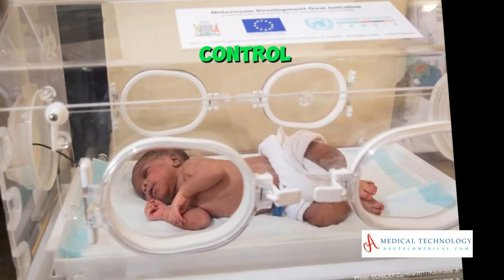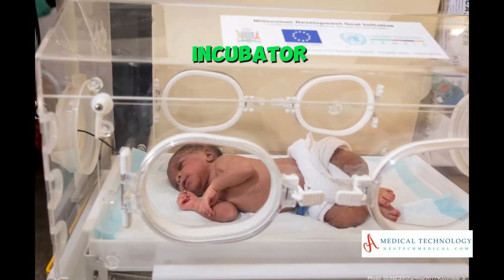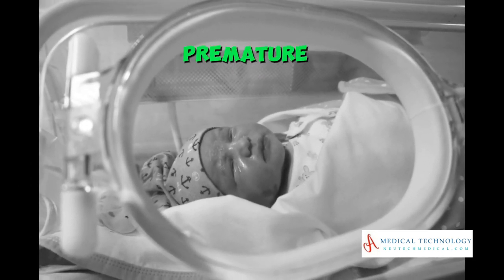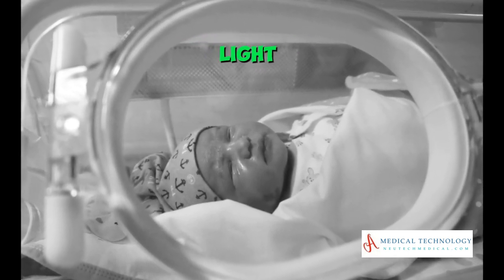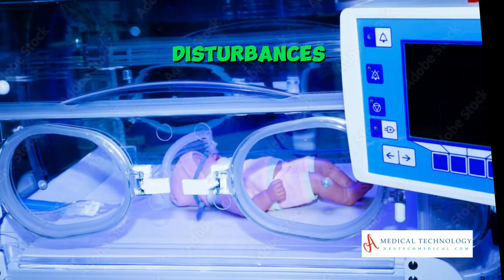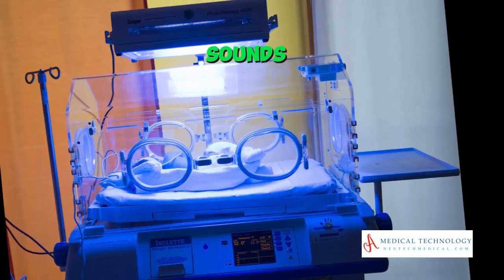Light and sound control — light dimming. The incubator may have a system to control the level of ambient light, as premature infants are sensitive to bright light. Sound reduction: to minimize noise disturbances, the incubator may be designed to reduce external sounds.